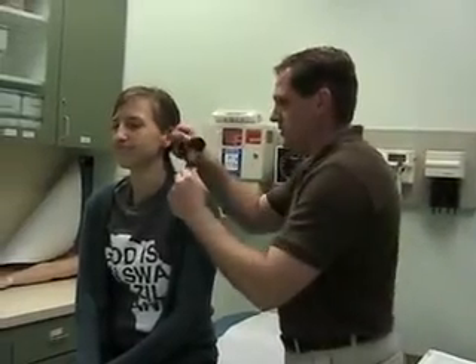There are two things you're assessing as you go into the ear. The first one is the tympanic membrane itself, and then the other one is the external auditory canal, or the EAC. The tympanic membrane is the actual eardrum, and the EAC is what you see in order to get there. If you're doing it correctly, the patient should not experience any pain — maybe a little bit of discomfort, but it shouldn't hurt them.